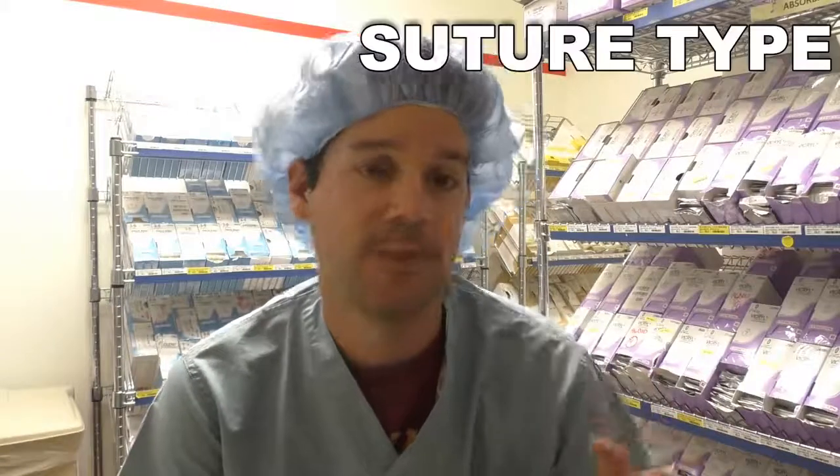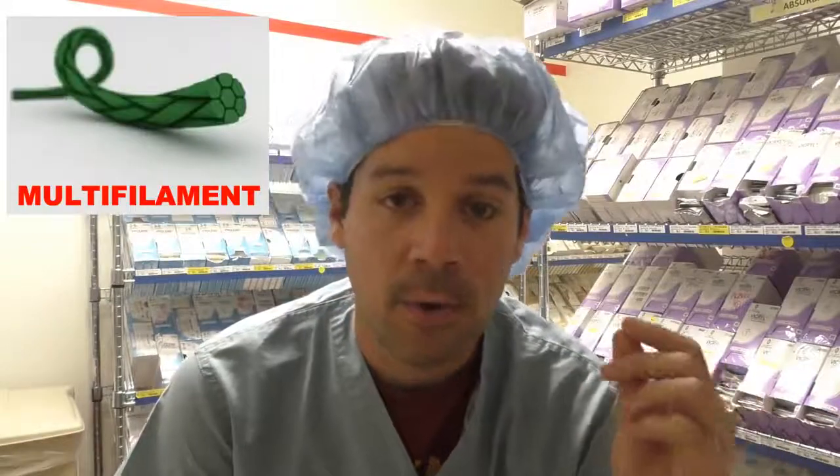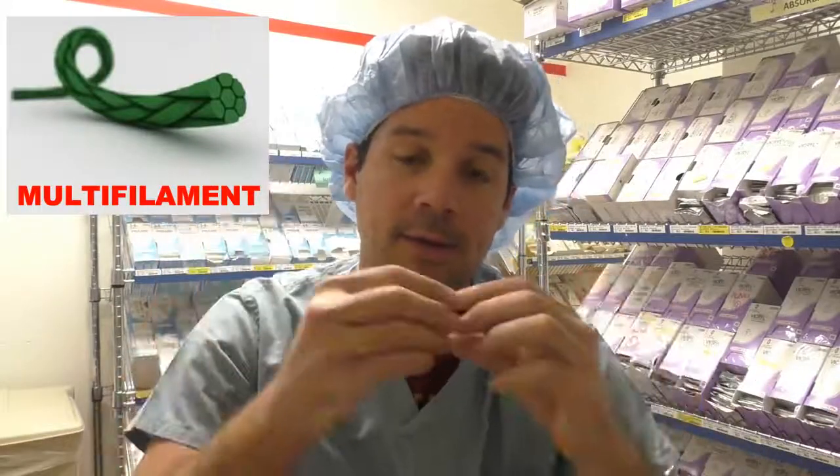Again, we can start off and make it simple and say that there's two different types of suture. There's a monofilament and a multifilament. Monofilament meaning that there's a single strand to the suture. And multifilament meaning there are multiple strands that are braided together to make the suture. Either one of those could be absorbable or non-absorbable. There's different kinds, different manufacturers. But monofilament and multifilament are the two main types of suture that you will see. But it spiderwebs from there. And that's what we're going to get into right now.